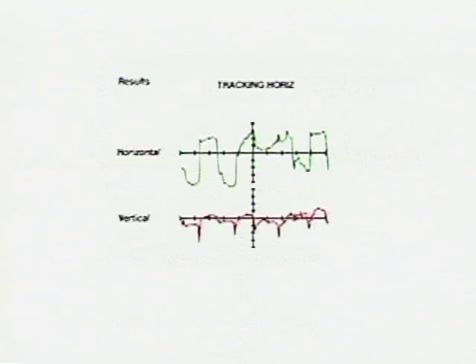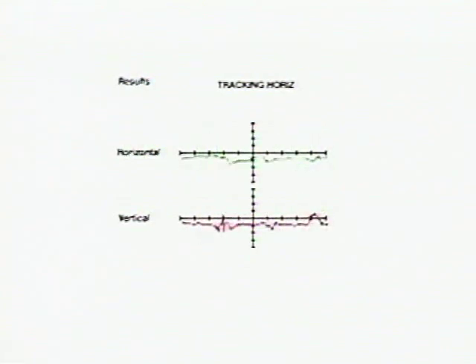The next is an overshoot, which demonstrates that the patient's eye movements actually move past and beyond the top of the target. And again, the lack of a continuous sinusoidal type motion. The final abnormality demonstrates an inability of the patient to track the slow-moving object at all and results in no sinusoidal motion whatsoever. All of these are common abnormalities.